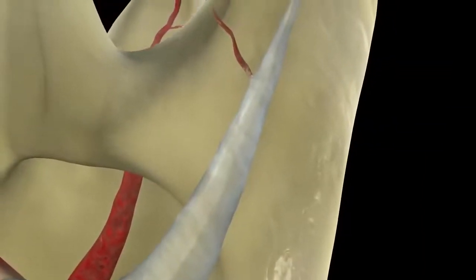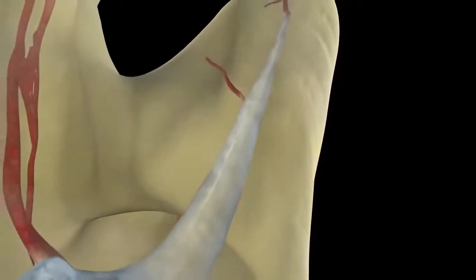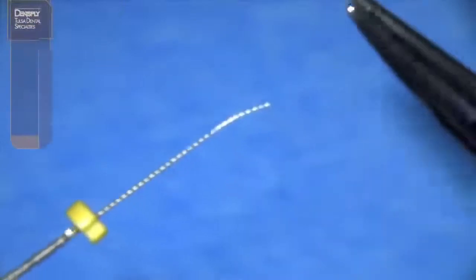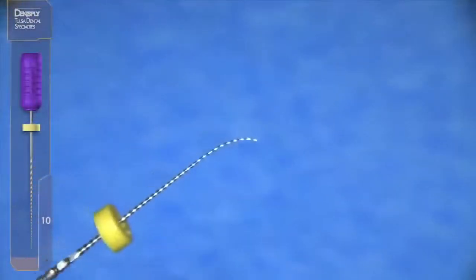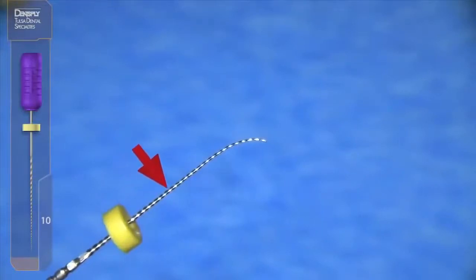Once we have thoroughly irrigated the chamber and the coronal portion of the canal, what's next is to imagine ourselves arriving at the radiographic terminus with the #10 file. Take a deep breath, relax, and curve the file from the shaft to the very tip.